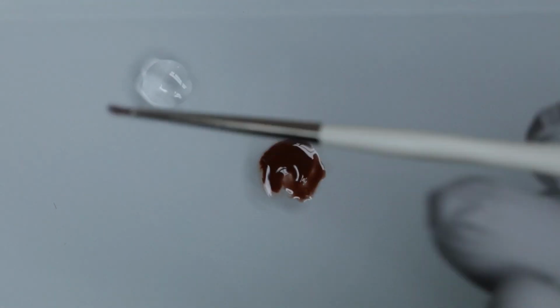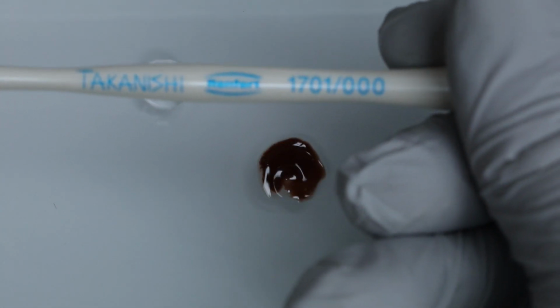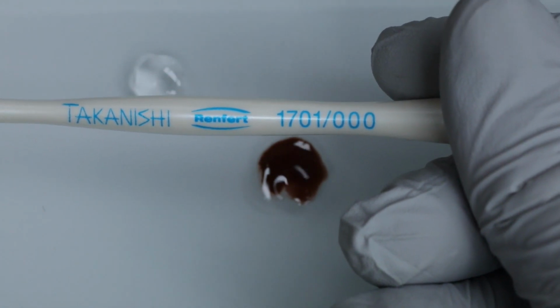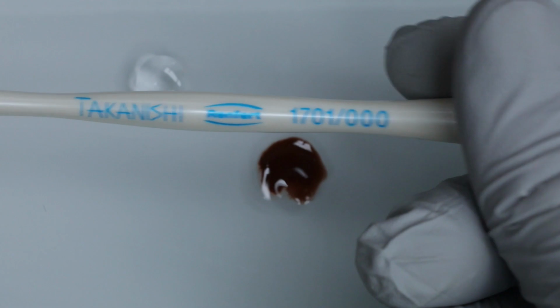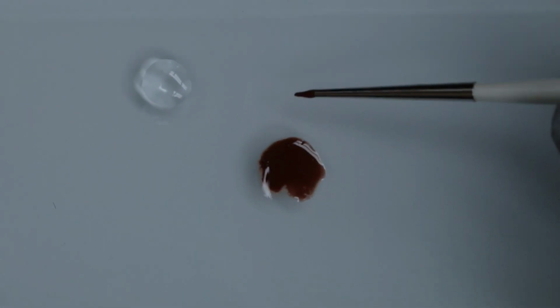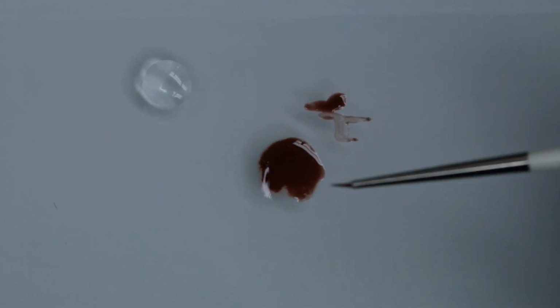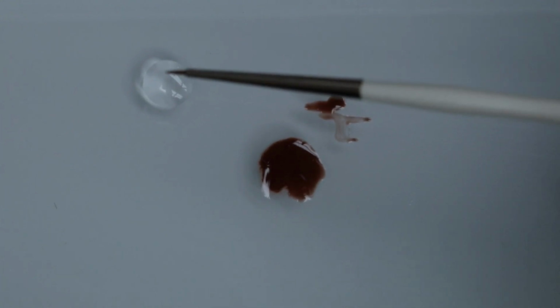This brush here is a brush I ordered, relatively inexpensive. I mean, you can use any type of brush, but the size is what really matters. So this is a 000, so that's a really small brush at the tip. That's something that you want to take into consideration when you're doing your staining and glazing, is not to have a huge brush tip. So this one, pretty small.